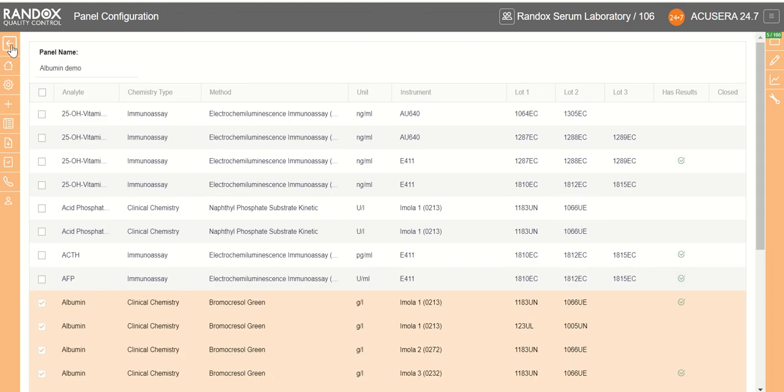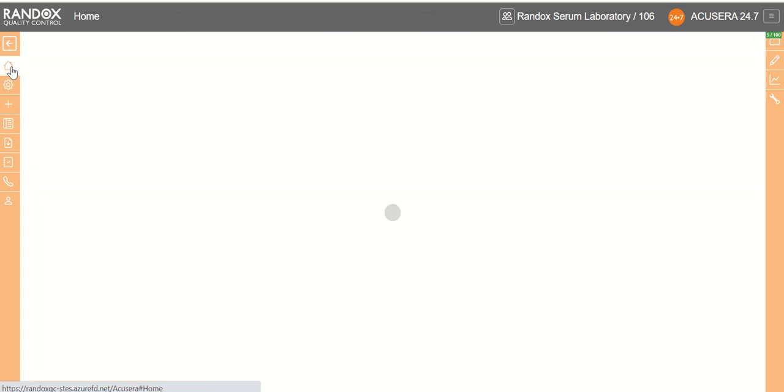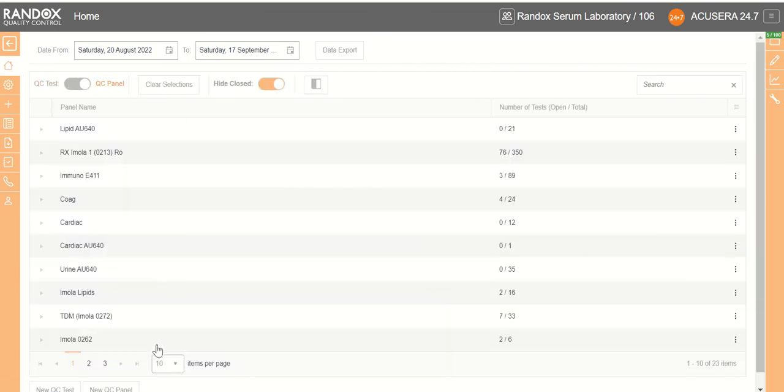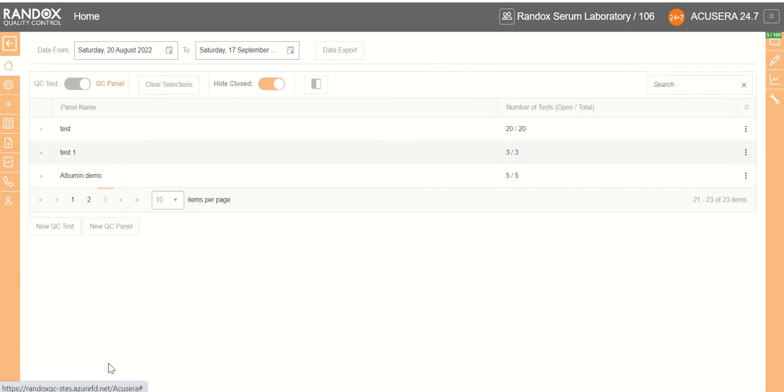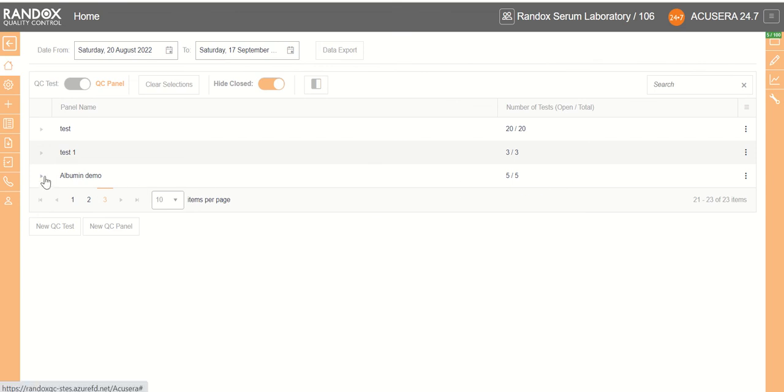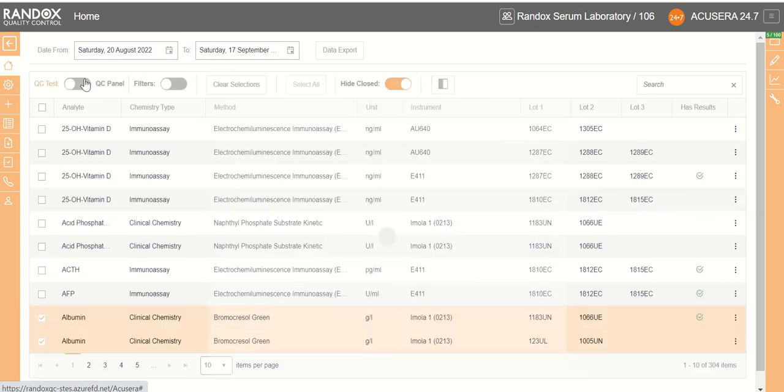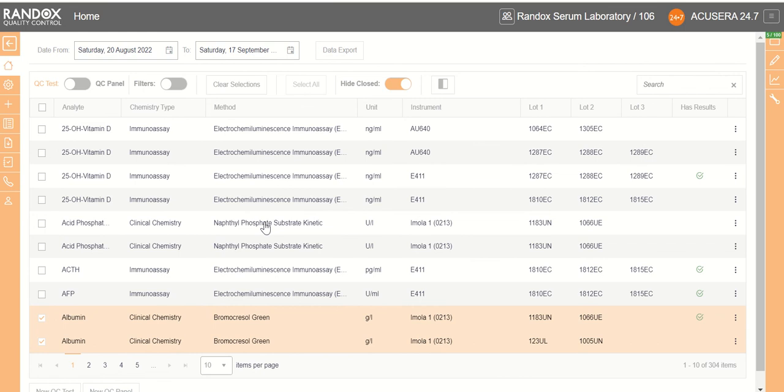So we hit back and click home, which brings us back to the QC test page where we can see our new panel. If we click under the triangle, it shows us the tests that fall within that panel. To return to the QC test view, we simply click the slider.